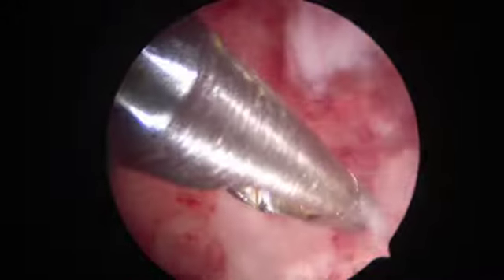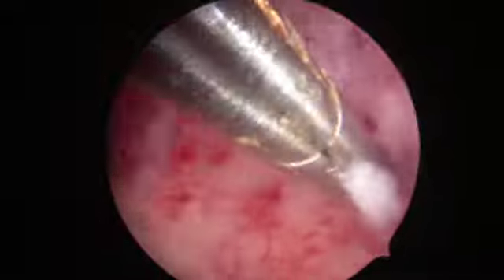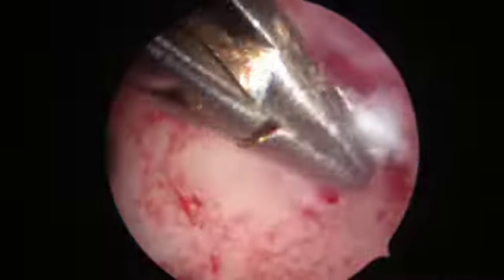You can appreciate that the base is fibrotic and it is taking time in removing. But the importance is, since we are suspecting it to be non-benign, the entire tissue should be removed.